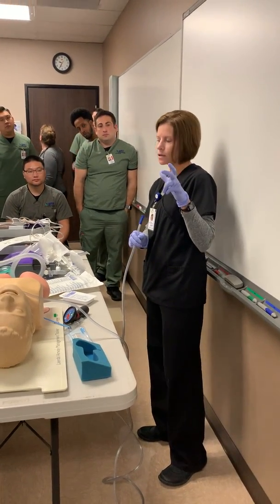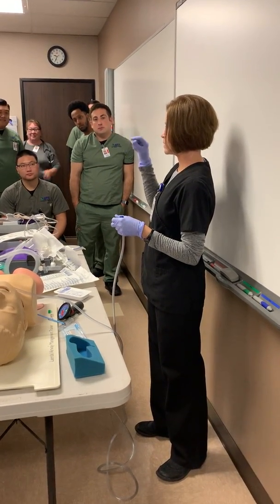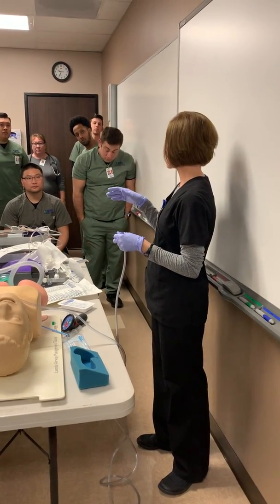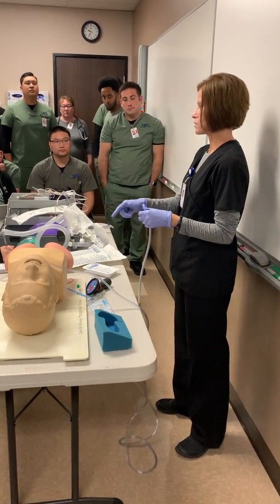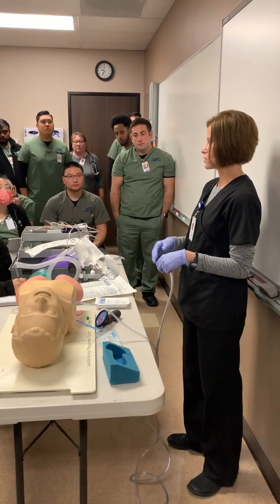There's also on a canister, on the back side, a little knob, and it'll actually say on or off. So make sure that's turned on. This is just all extra information, but start to think about it. The final thing is sometimes the canister will be full and then it won't give you any suction. So before you ever put on sterile gloves, make sure your suction is working.